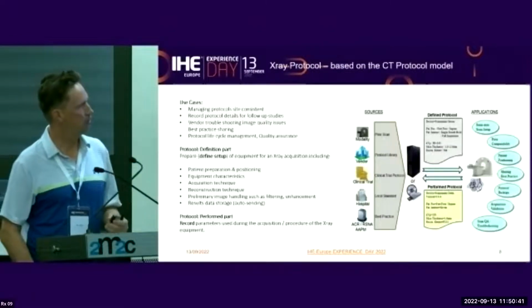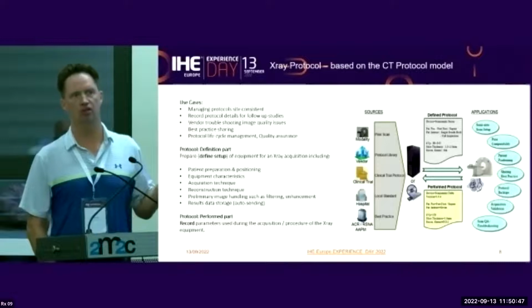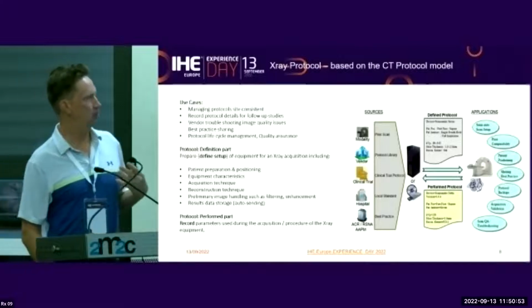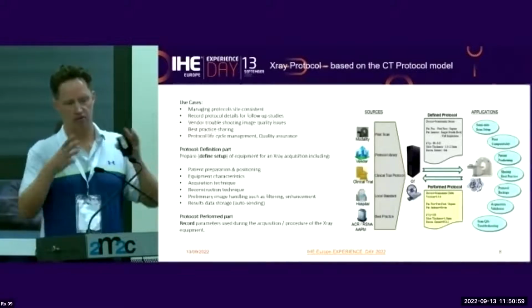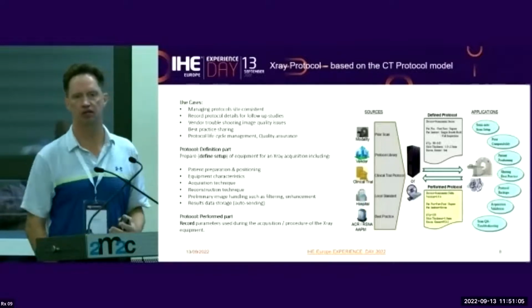The next one is the protocol for X-ray. So this was modeled after the protocol handling for CT. And the idea is that you want to manage the way you do studies in the hospital. You want to have ready templates, protocol templates of how a specific acquisition should be done in the hospital.